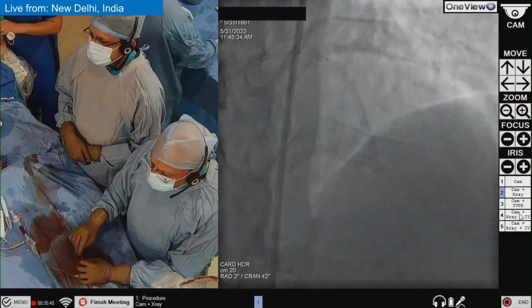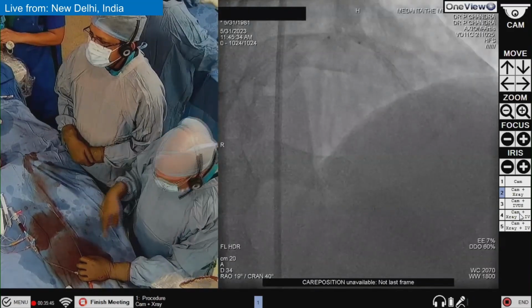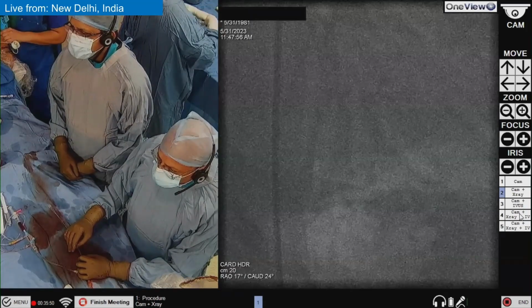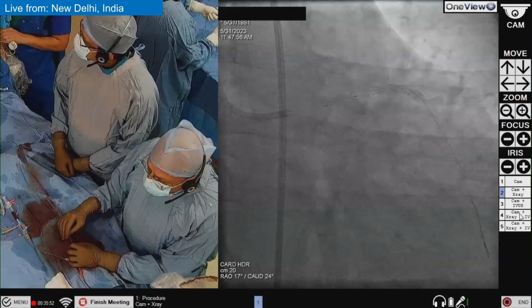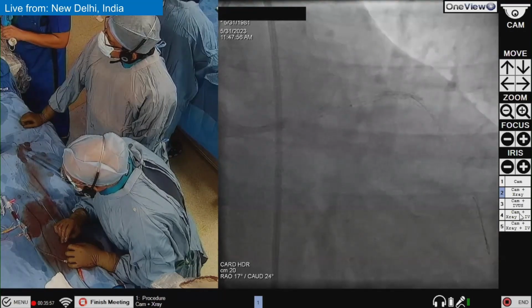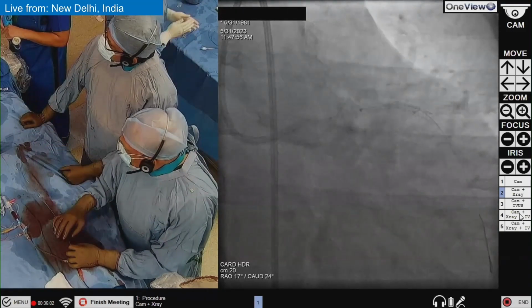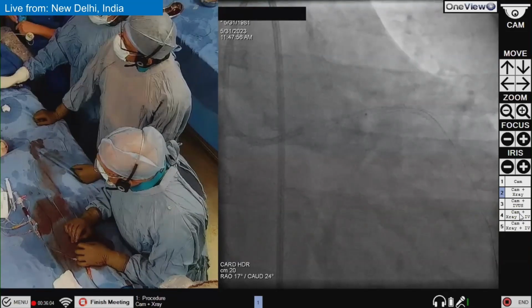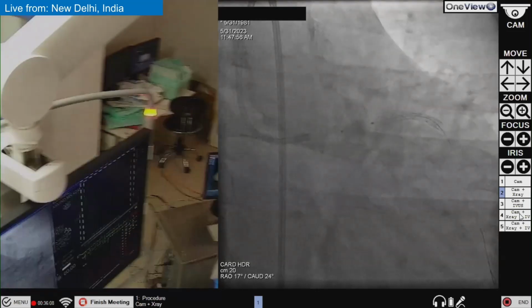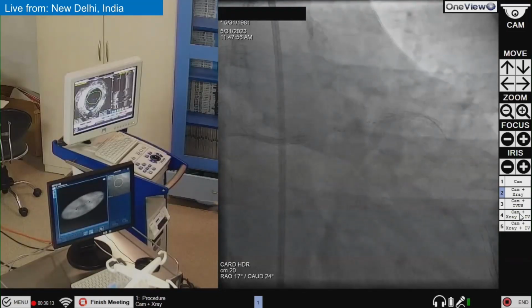Caudal. Okay. So this is fantastic. And we can do this thing, stent boost. You can look at the stent boost enhancement, which is on the Volcano. Now this system is a very interesting one, which is an offline system, which is continuous. And I can see it very clearly without doing any digital imaging. So we can see that it is very clear. Can somebody focus on this one?